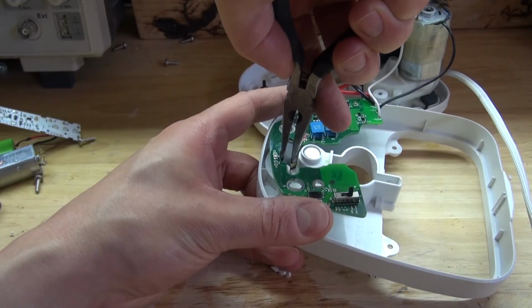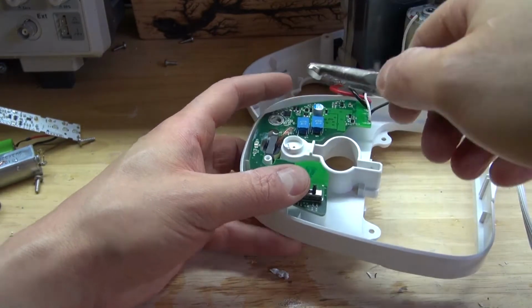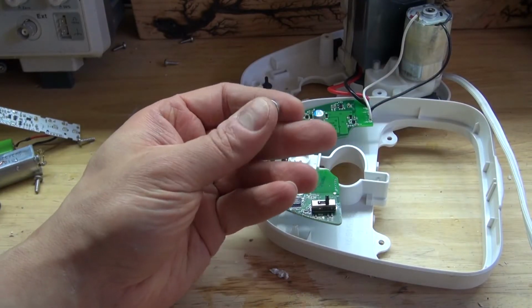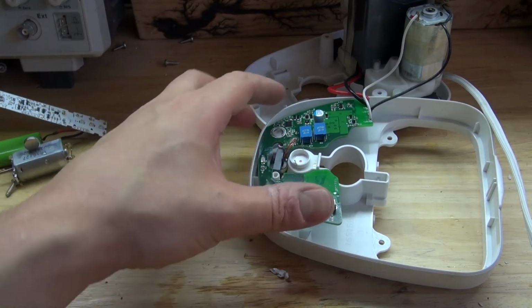And now let's go ahead and remove the second half of that transformer, which I call the primary transformer. Oh, a neodymium magnet. Of course, it makes sense, allowing the toothbrush to sit in place. A very nice neodymium magnet. Definitely going to use that for something. Put that to the side.